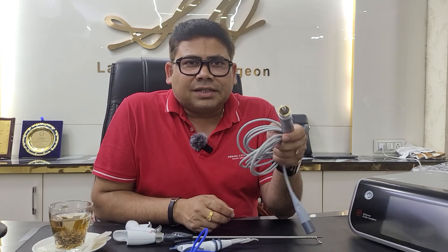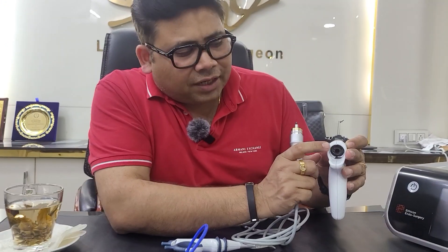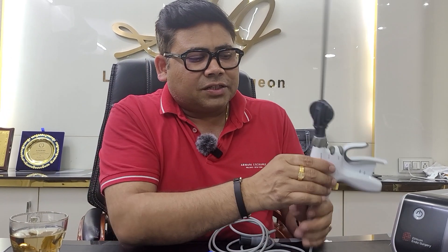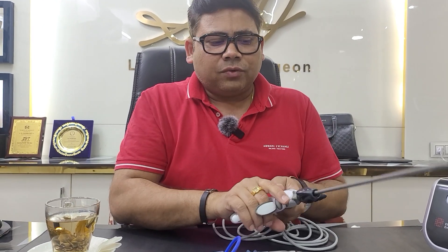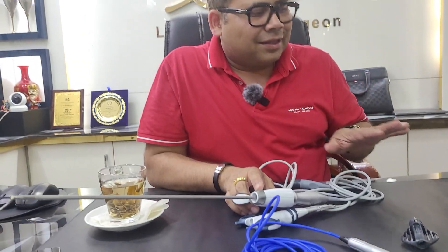Let me tell you what this system is all about. The most important thing we have is this handpiece — this is the ultrasonic transducer. There is a cavity here to which this ultrasonic transducer will go. Once it has gone, you need to rotate this instrument to tighten it up. To tighten it further, we have a tightener. The moment you have two and a half rounds, it is okay, and then the handpiece is connected.